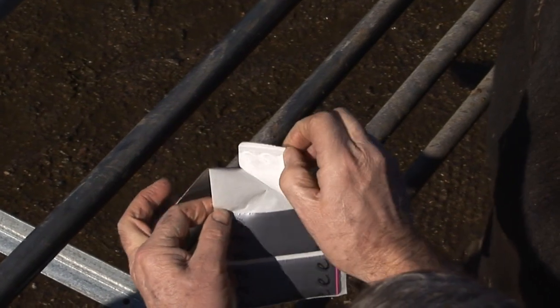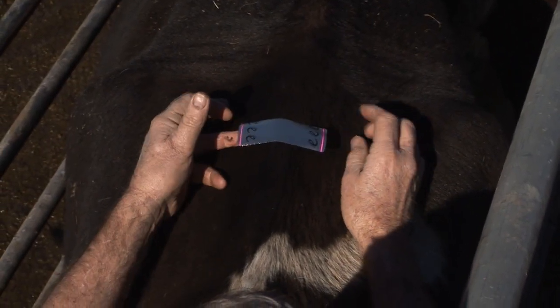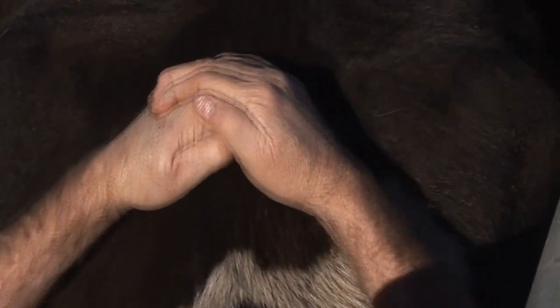Simply peel the Scratchy from the backing paper and position correctly on the cow, perpendicular to the backbone. Apply pressure to the whole detector to ensure good adhesion.